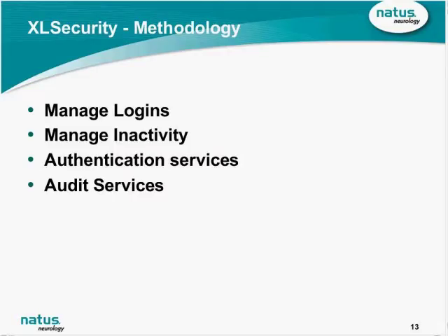Alright, so let's talk about the methodology that XLSecurity employs to provide you with the protection, the privacy, the accountability that we talked about, and the data integrity. So how does it do this? It's able to provide these benefits by utilizing a login management system.